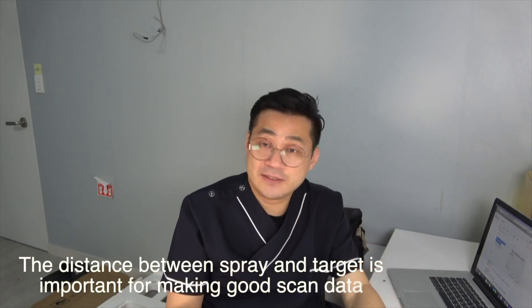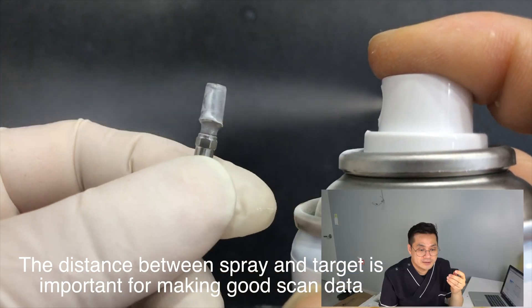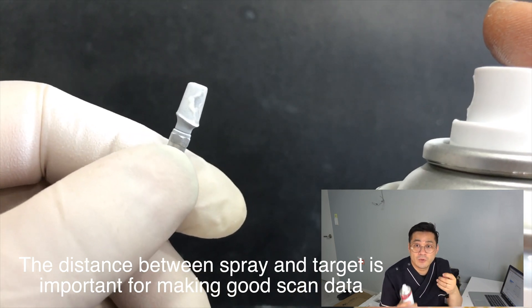So what are the important things when you use scan spray? In my case, first: the distance between the spray and the target. This is a very important thing that determines scan quality.